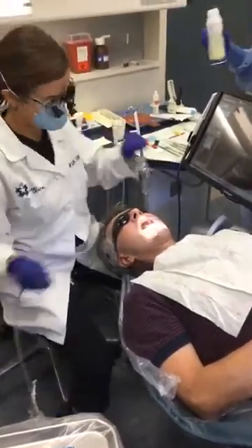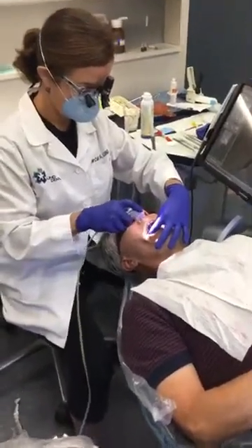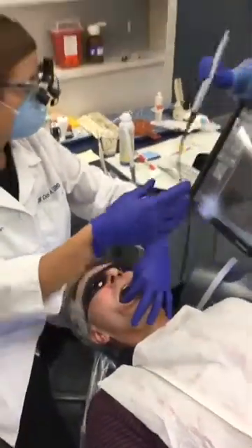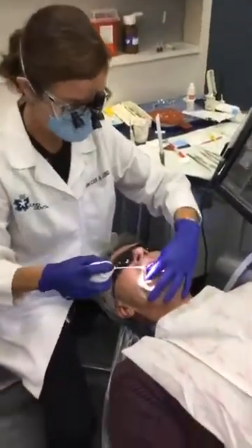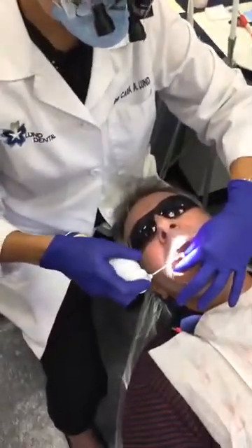The next thing we do is we are going to spray a little powder — the same powder that makes the M&Ms. Turn to the right just a little bit. It kind of has a minty flavor actually.